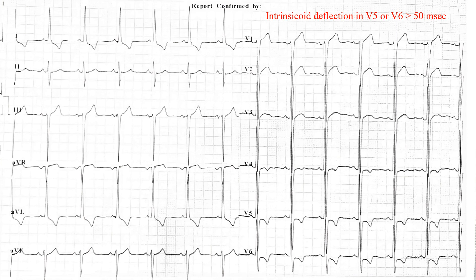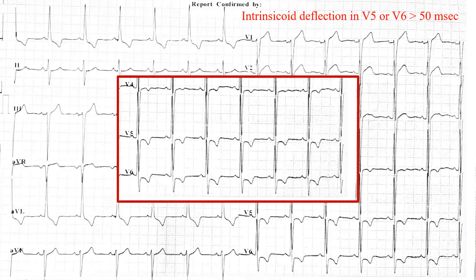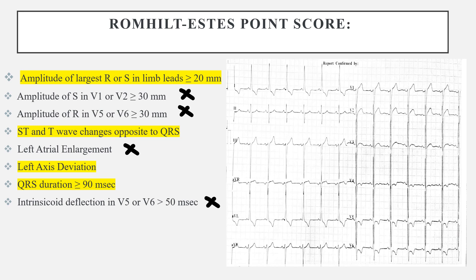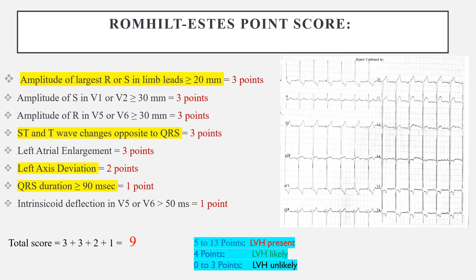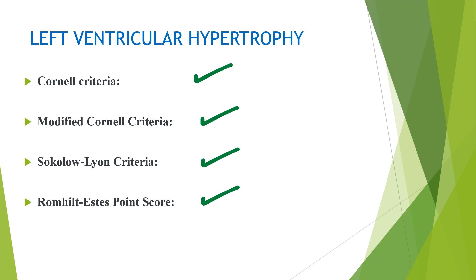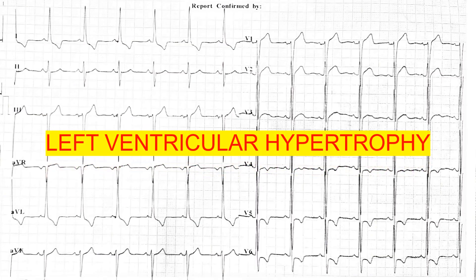The final parameter is intrinsic deflection in lead V5 or V6, which should be more than 50 milliseconds. Applying this threshold, the deflection was a fairly sharp, rapid deflection and was not more than 50 milliseconds, so this criteria was not met. Combining all the parameters that were fulfilled, this patient received a Romhild score of 9, which clearly confirms that the criteria for left ventricular hypertrophy is being met. All four criteria are now fulfilled, confirming this patient has ECG findings consistent with left ventricular hypertrophy.